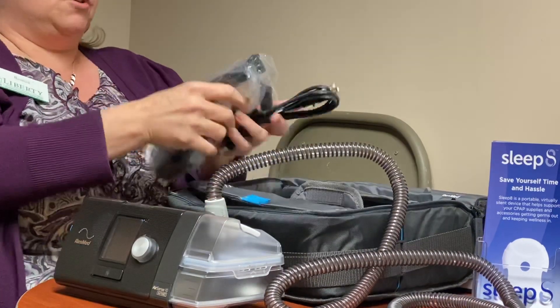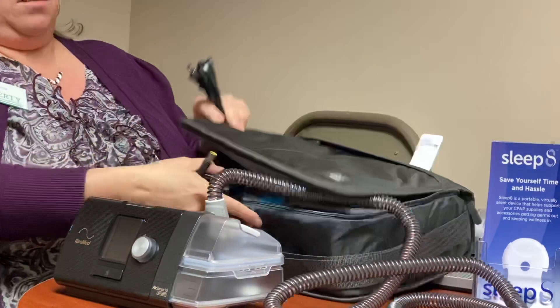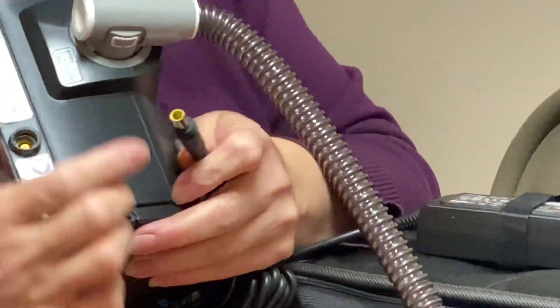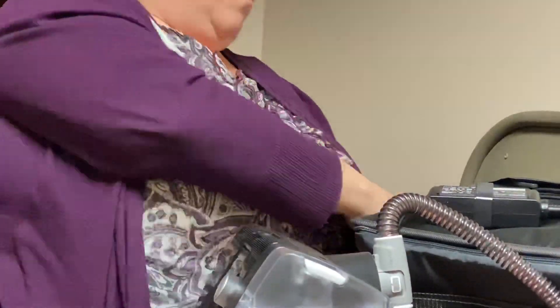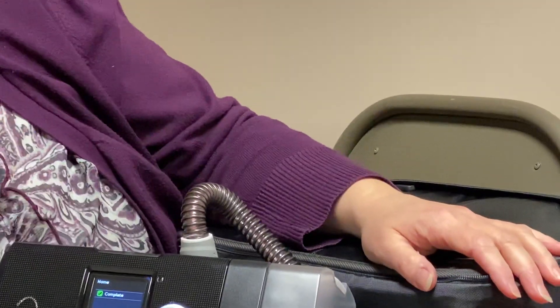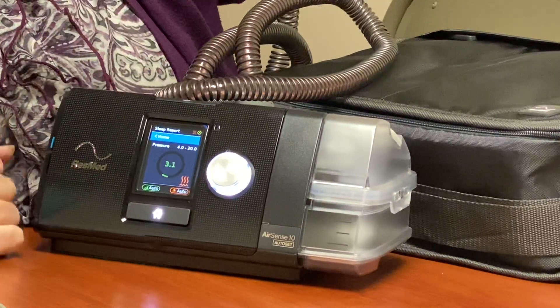Now the next thing you're gonna do is pull out your power cord. Your power cord comes in two pieces, and you want to remember that — so that in the future if the power is not working on your machine, that is one place to look. It connects in the center and then connects to your machine. Only use this power cord for this machine. We will have your machine set to your pressures based on your prescription, so you would just go ahead and plug it in and it will turn on for you.